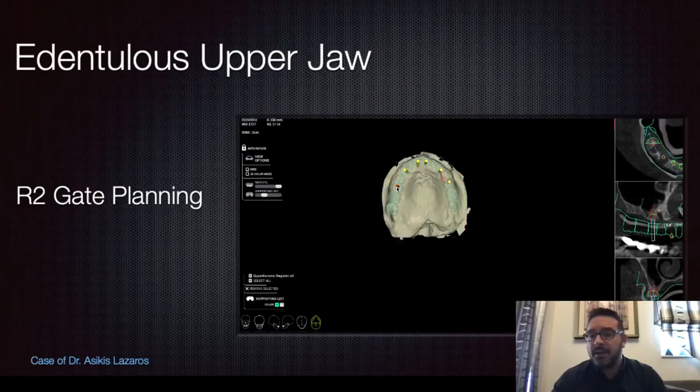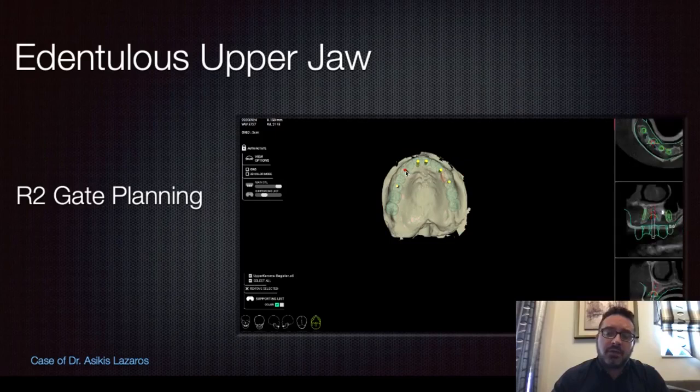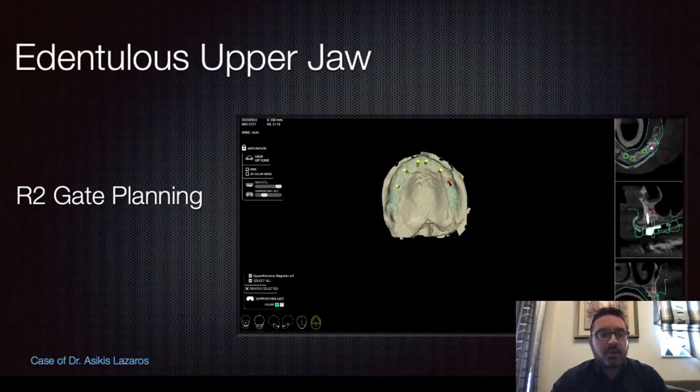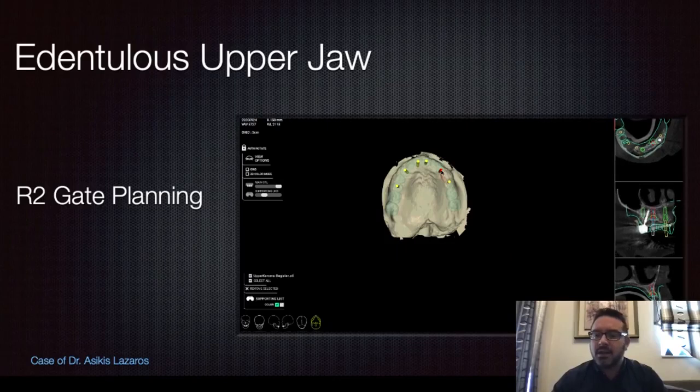If we can find an ideal position so that we can use an easy post or a CCM abutment or something cheap for the dentist, but always official from Megagen, that is our willingness. We don't want to get a lot of money from our patients.